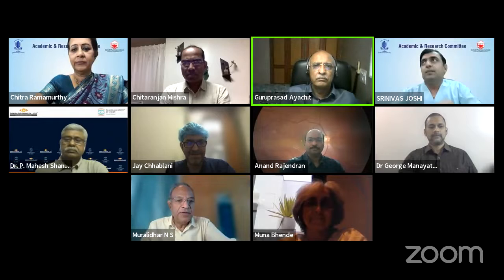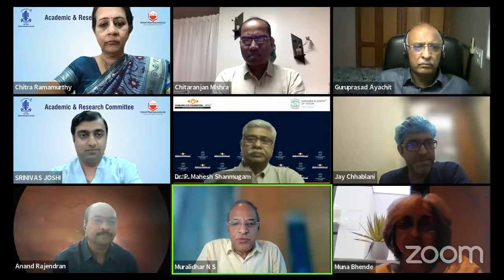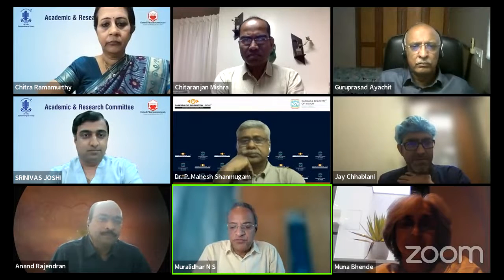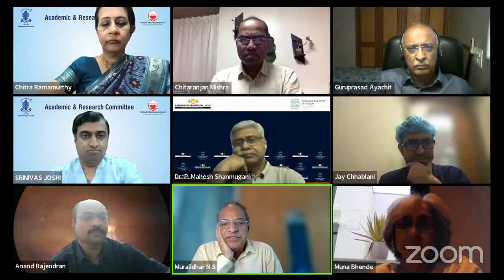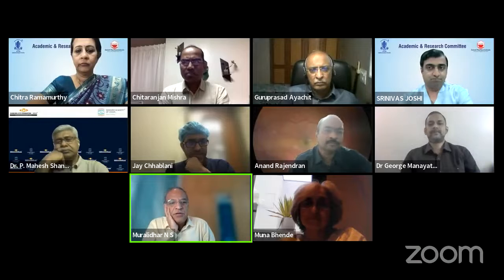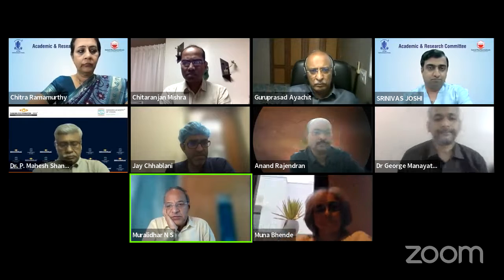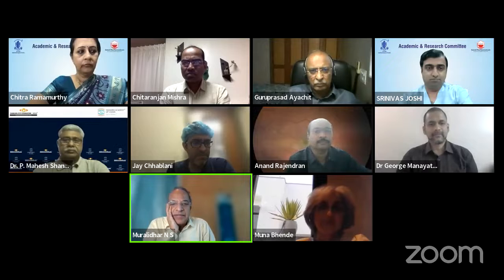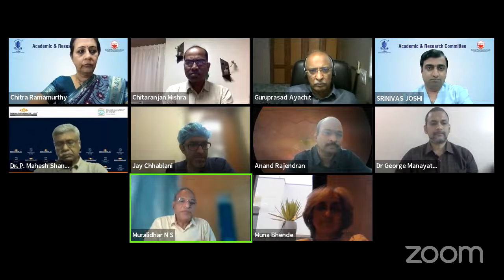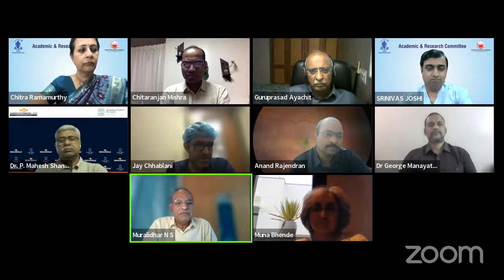Thank you, Jay. That was a wonderful presentation of the use of OCTA. And especially as I agree with you that the chief use of OCTA in chronic CSR is to detect CNVMs, which sometimes even on FFA or ICG are elusive. One of the things that often baffles me is, when there is an atrophy and choroidal vessels showing through that, sometimes there could be a confusion regarding CNVM versus the normal choroidal vessels, and sometimes we really find it hard to distinguish. What are your tips on this?